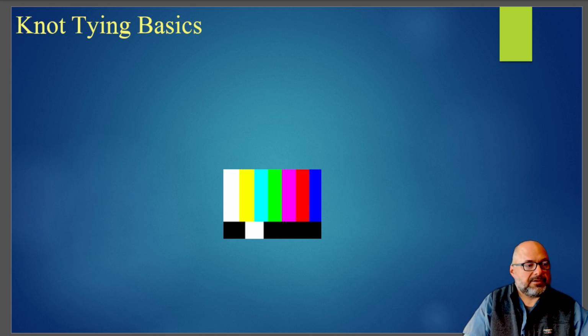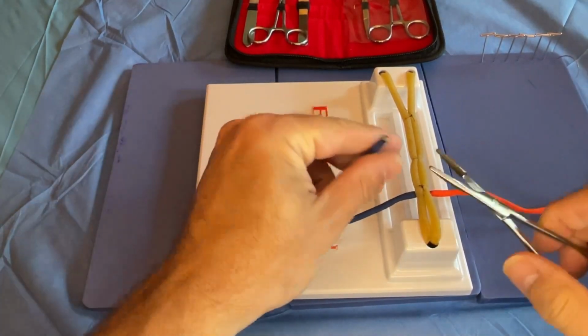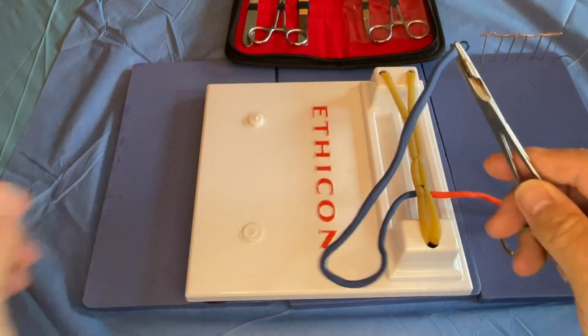All right, so let's look here at some very fundamentals of knot tying. We're going to watch a little video. All right, let's talk about some basic knot tying. We're going to go through a two-handed knot first, and then a one-handed. Now, there are lots of different ways to do this. What we're going to do is to start off as if we have a needle on this side.